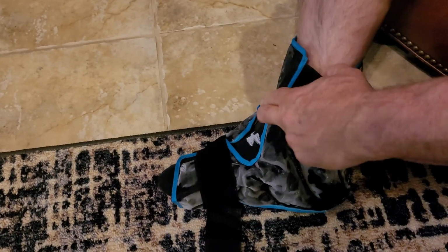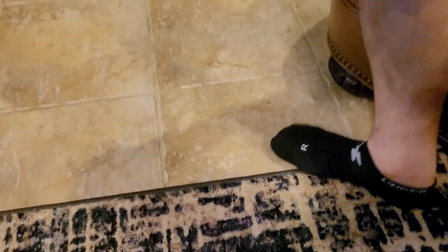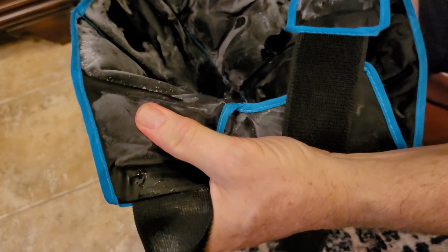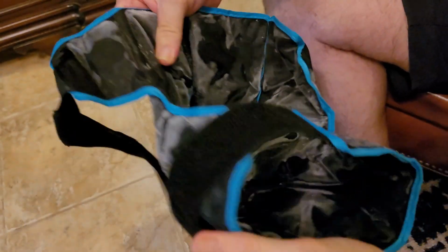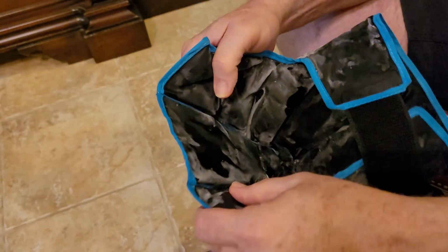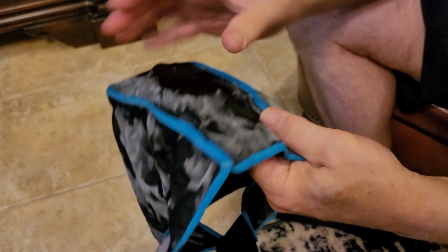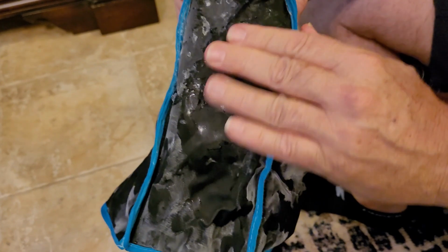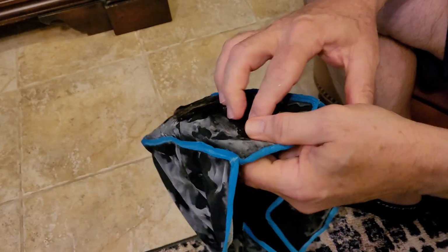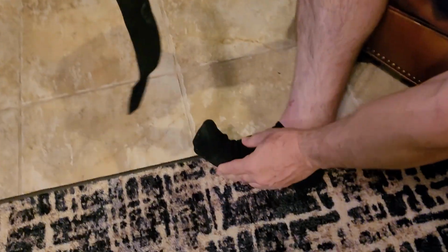Let's take a look at where the coldness is coming from. You have a good chunk of gel here. Not as much gel here. That would be the edge of the foot. No gel here, but you have it here in the arch. So below the toes, up here, it's not much.